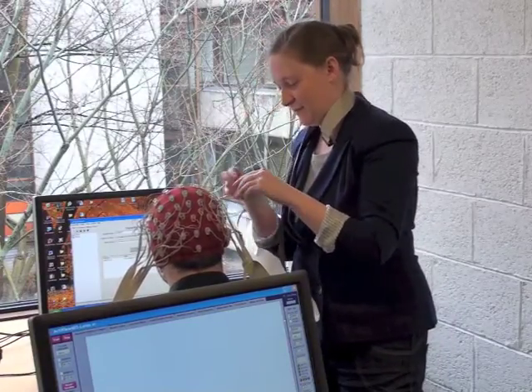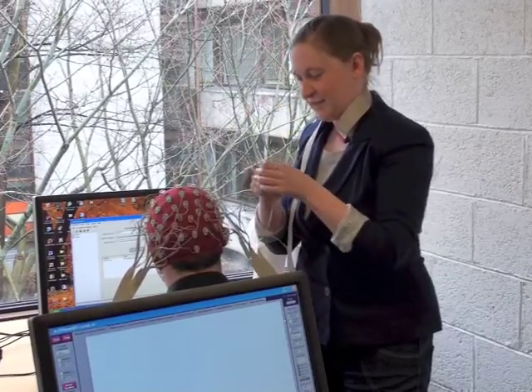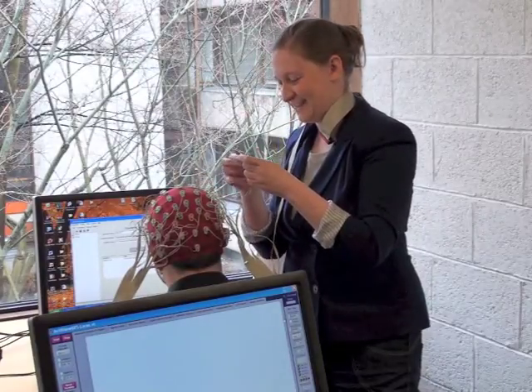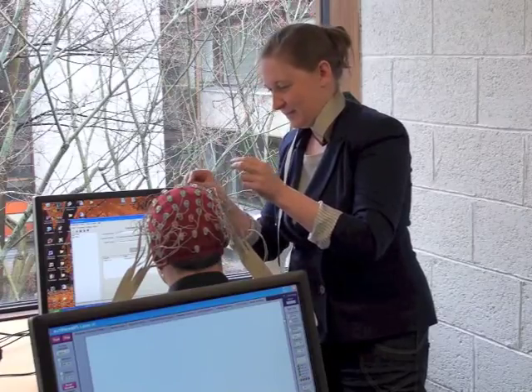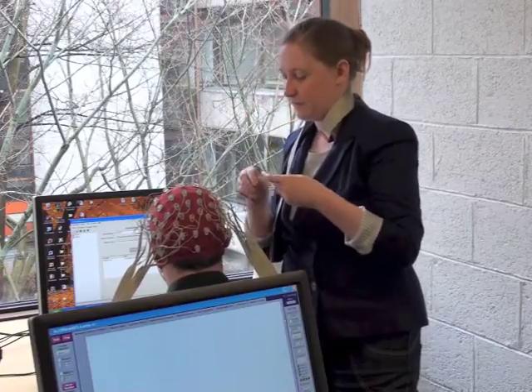Now, I know I've been kind of rushing this, so I'm hoping it's all going to work. It's definitely not going to work. You do tend to rush it anyway because you're so worried that the participant's going to be upset, or you feel kind of apologetic for putting them through all this. I suppose if you've been clear at the start about how long it's going to take.